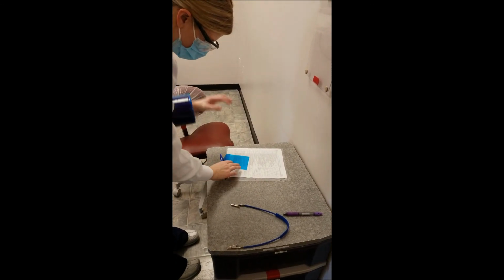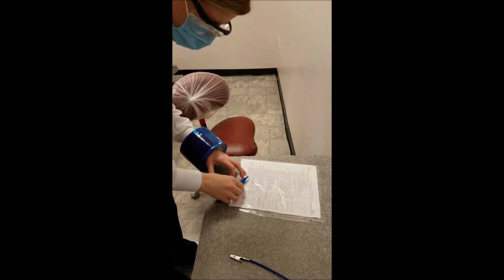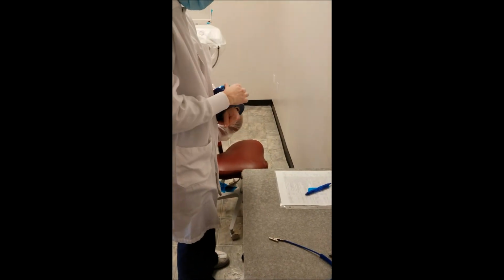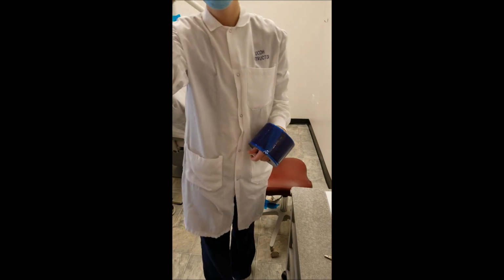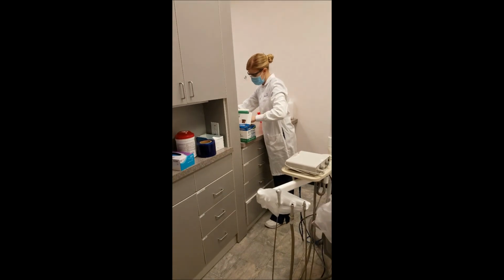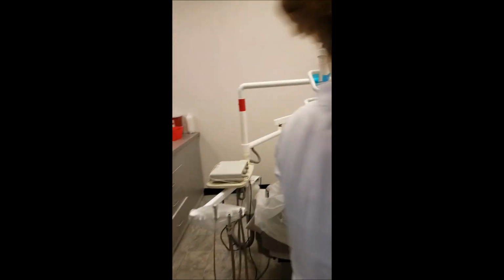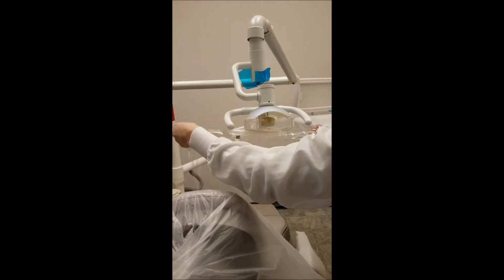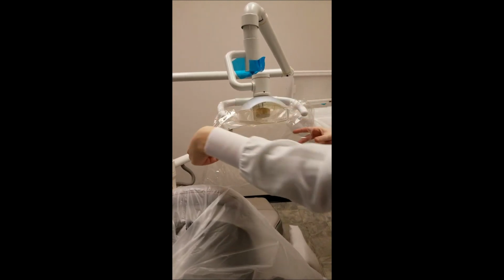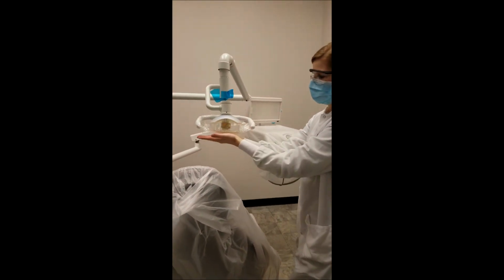A great helpful hint for you guys is to fold one side, roll your tape up so that when you go to take it off, it's much easier and it's not sticking to itself. Okay, and then she will barrier the light handles. Another helpful hint is whenever we barrier this, we only barrier the face, not this side or on top at all, just the face of it. This light heats up and will melt the plastic, so only across the face.